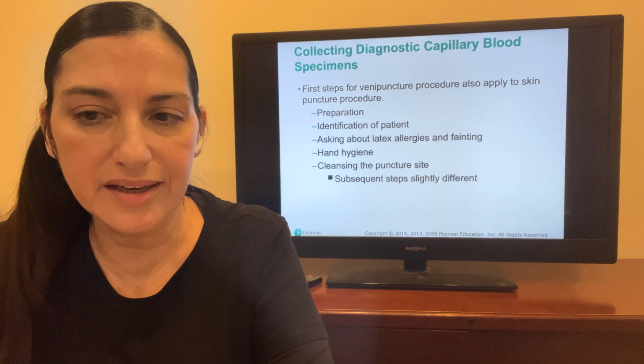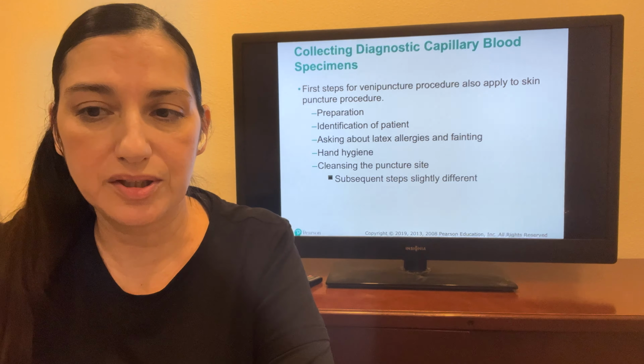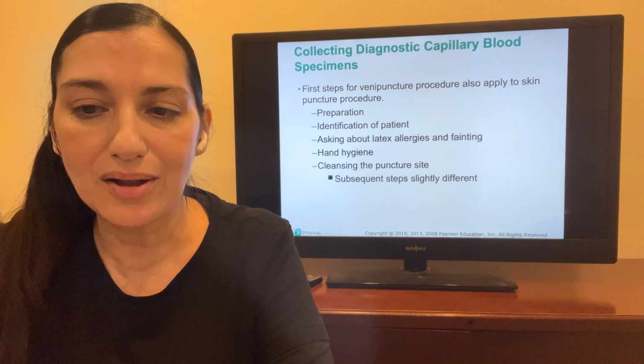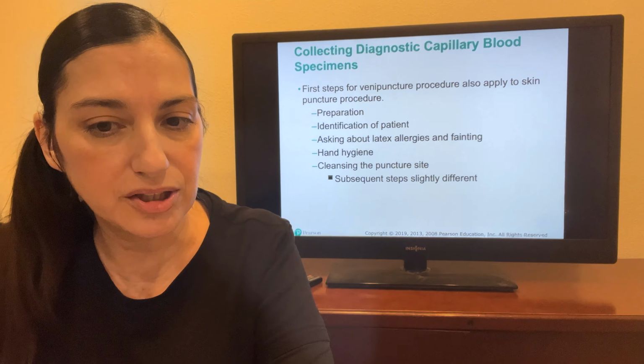Collecting diagnostic capillary blood specimens. First steps for venipuncture procedure also apply to the skin puncture procedure. Preparation, identification of the patient, asking about latex allergies and fainting, hand hygiene, cleansing the puncture site. Subsequent steps are slightly different.